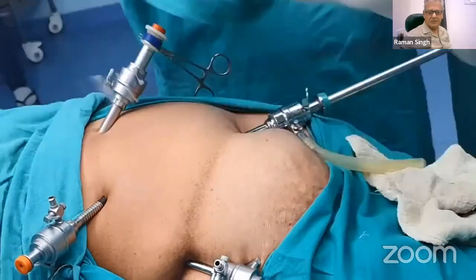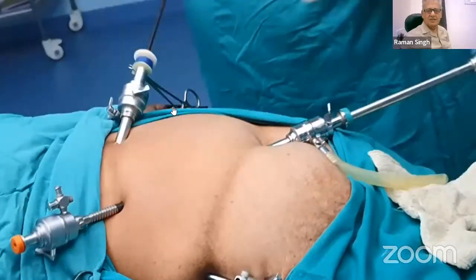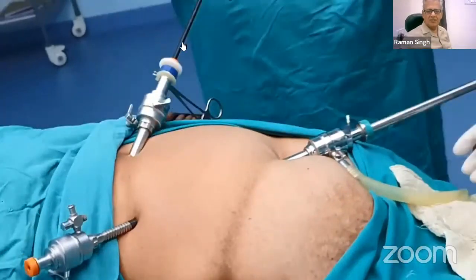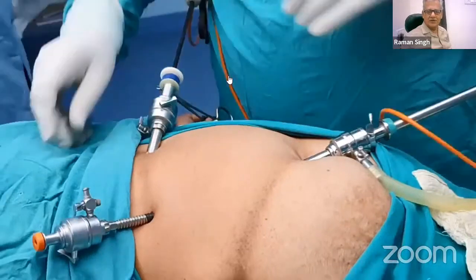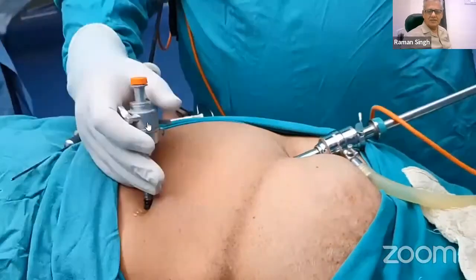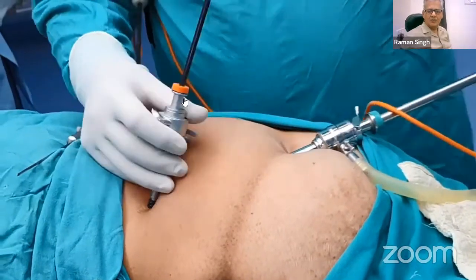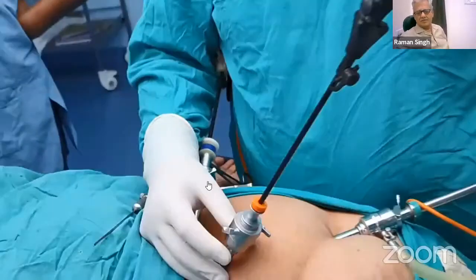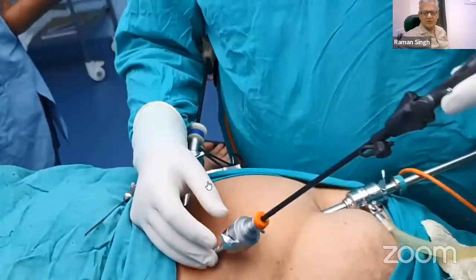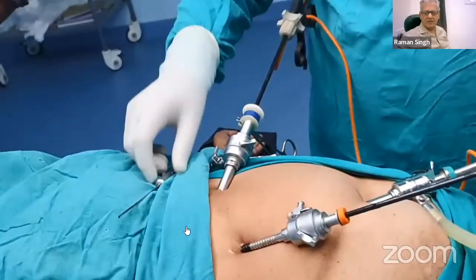This is the camera port. The gallbladder fundus is pulled upwards. Now this is the working port. This working port, which is a dissector, is attached with the cautery. This is the third port, where you introduce the grasper to hold the infundibulum or Hartmann's pouch of the gallbladder, to pull it laterally so that we dissect away.